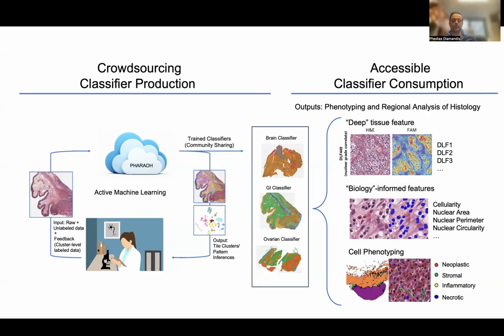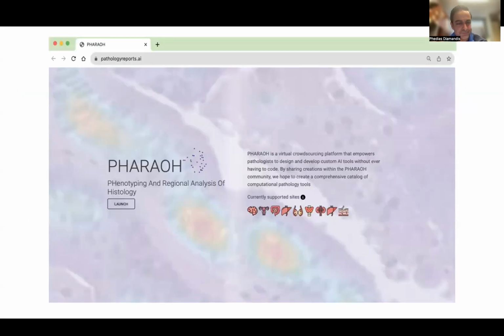And then we also use a popular classifier in the literature called HoverNet that allows you to phenotype the cell types within those regions as well. Are they neoplastic? Is there a strong inflammatory or stromal component? And so you get that information for free by using the developed classifiers in each region. So you don't have to reinvent the wheel for each classifier you develop. And we think that helps with the generalizability and getting immediate markers by only having to train a few classes.